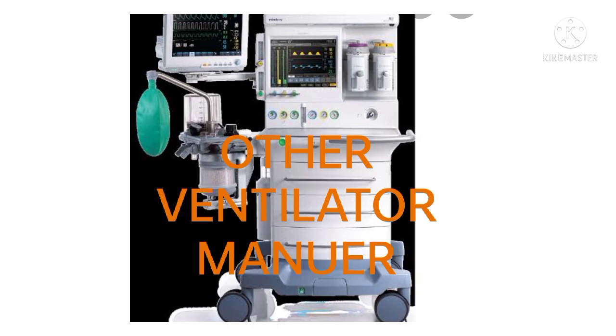CPAP can be administered through a tight-fitting mask or an endotracheal or tracheal tube. CPAP increases WOB because the patient must forcefully exhale against the CPAP. Therefore, it must be used with caution in patients with myocardial compromise.